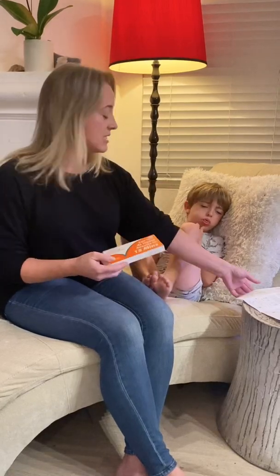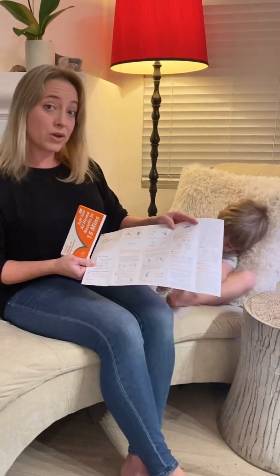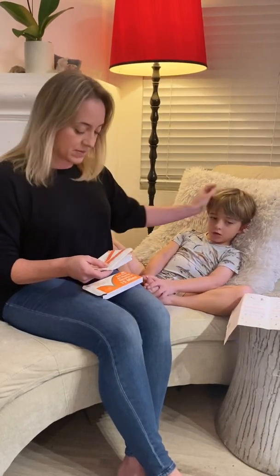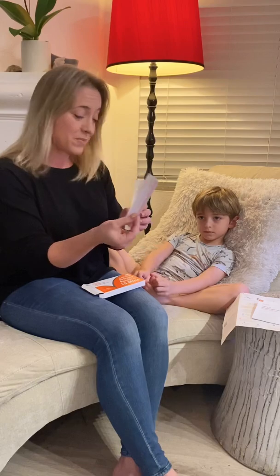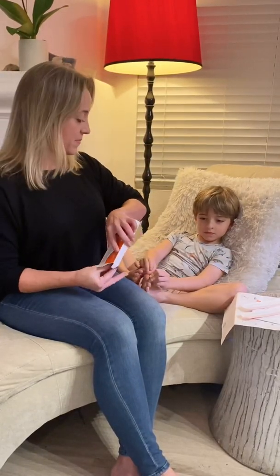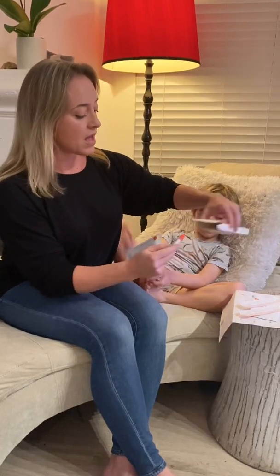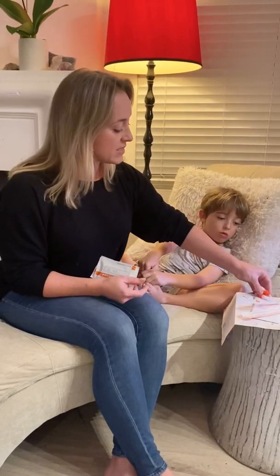The at-home test includes directions which are very clear, so make sure to look at this before you start so that you're clear and you've got everything laid out. You have the swabs — you're only going to need one, but you have an extra one in case you drop it or it gets contaminated. You don't have to wear gloves, but I do recommend that you wash your hands so that you don't risk contaminating the specimen.